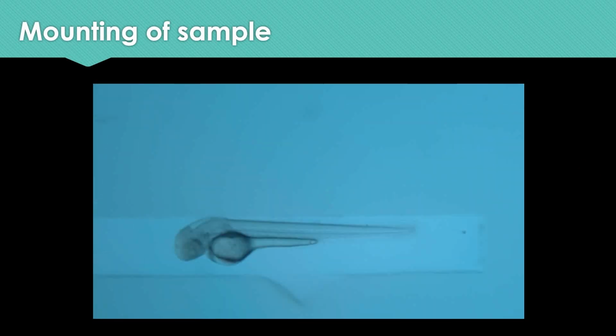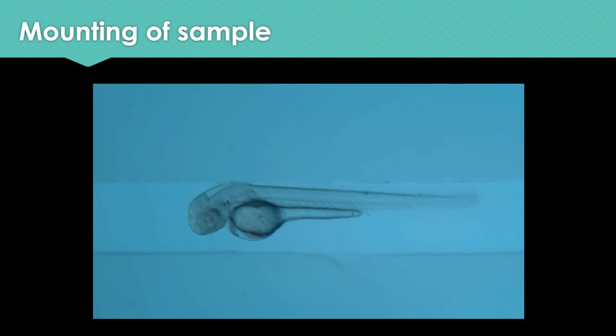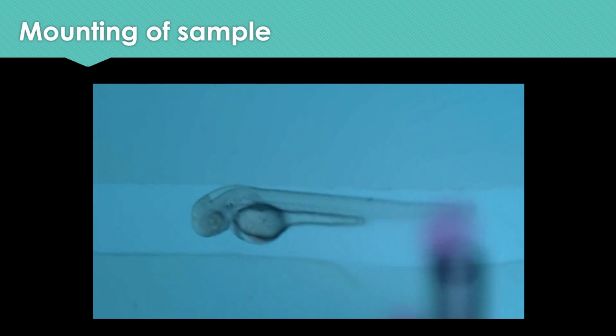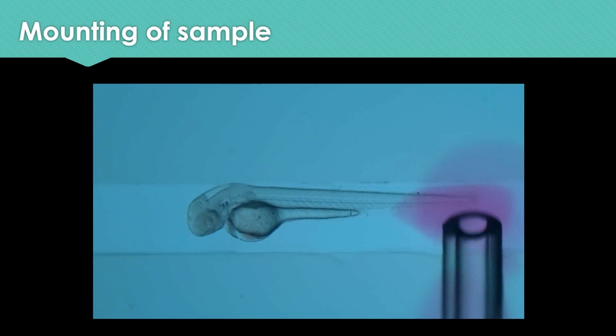Here, in this mounting video, a zebrafish larva at 2 days post-fertilization is placed in a Petri dish with an agar well that is stained with methylene blue to provide contrast for us to see. And the zebrafish larva is placed inside the well, oriented to the side that we want to label. And once the zebrafish is well rested in the area, it has also been anesthetized so it doesn't move for long periods of time, allowing for imaging for prolonged periods.